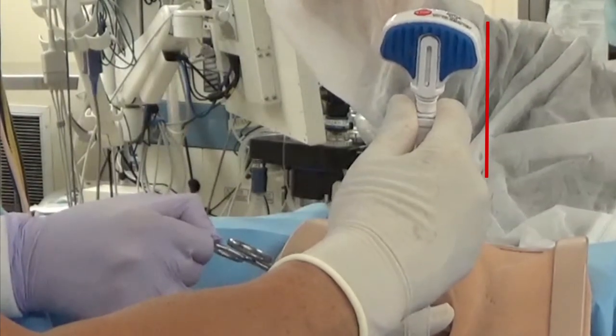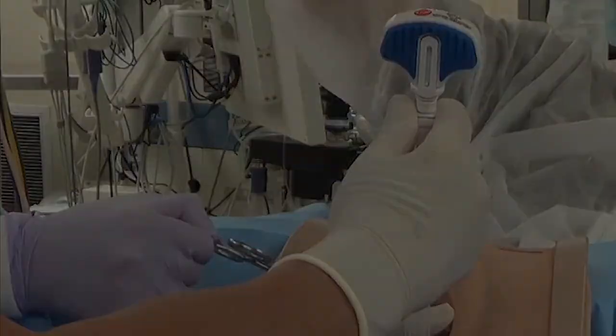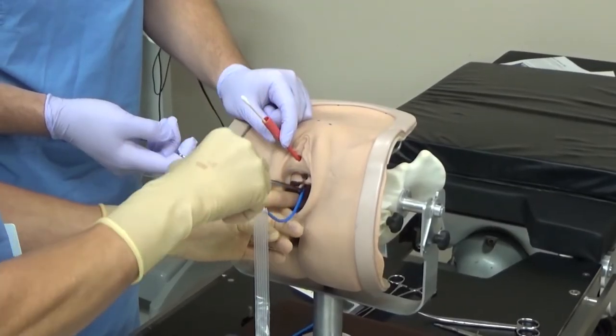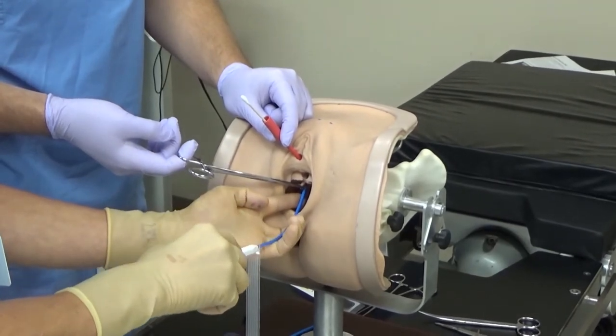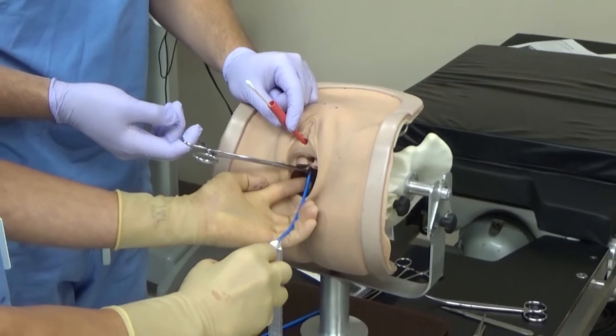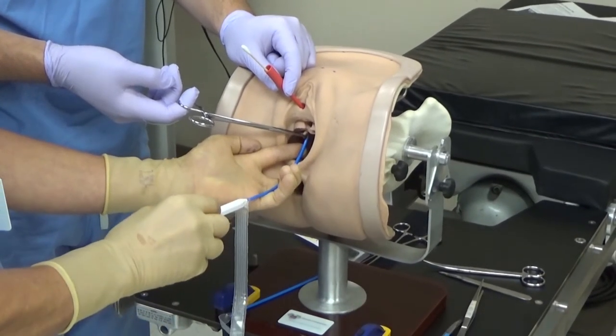The tip is advanced slowly and the urogenital diaphragm is pierced. About 2 centimeters of forward advancement is usually sufficient to pass underneath the pubic rami bone. The handle is then dropped to bring the tip just under the pubic bone on the retropubic side. The trocar handle is then brought back into the sagittal plane.